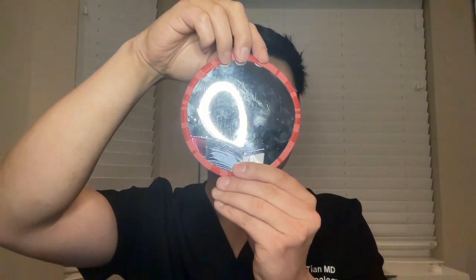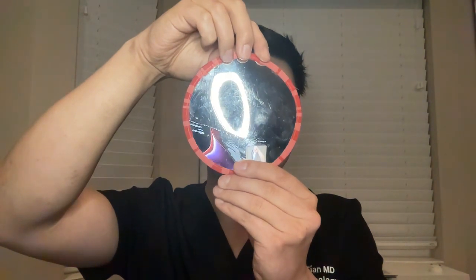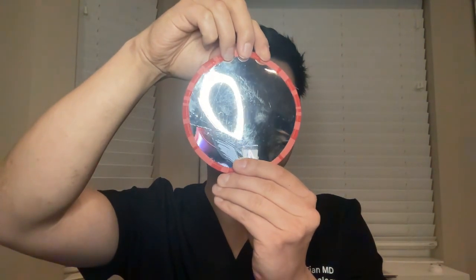And if we compress that even more, this would represent a higher power of astigmatism.